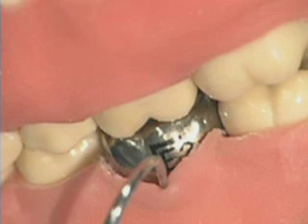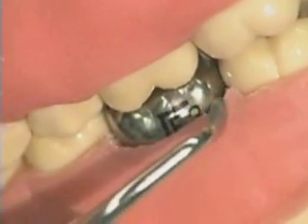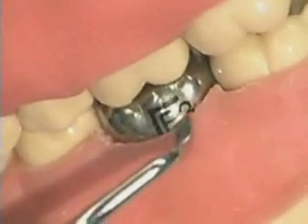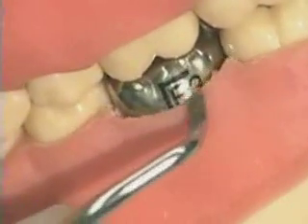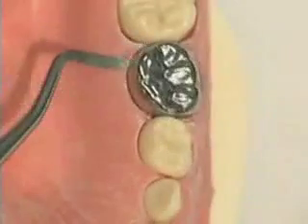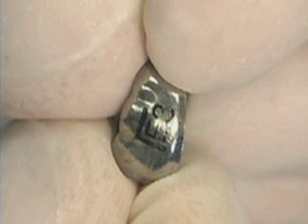We'll shorten the crown length so that the gingival margin of the crown seats to 1 mm below the free gingival margin. First, score a thin line using a sharp spoon excavator resting on the free gingival margin. If you use an explorer the scratch mark will be too wide, so use a sharp spoon excavator. Do the same thing on the lingual surface. Then use the spoon excavator to lift the crown off. The scratch line is well below — greater than 1 mm — so this crown needs to be shortened.